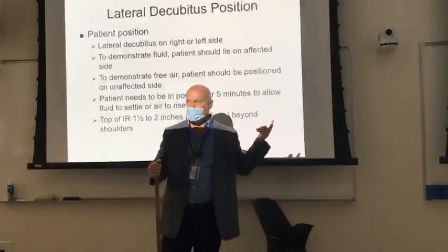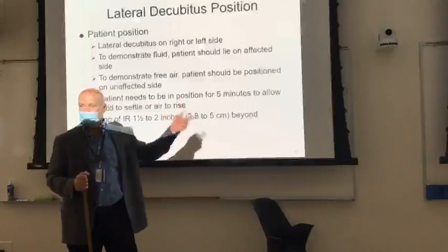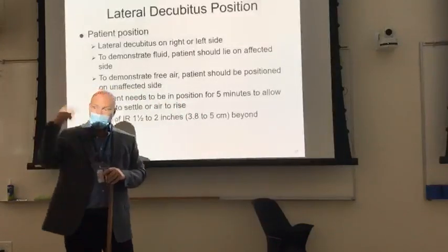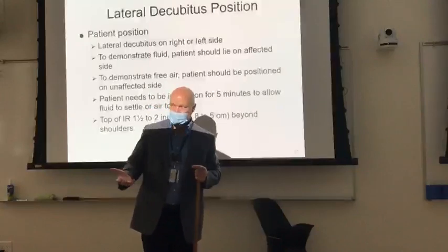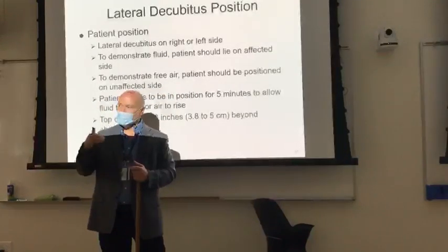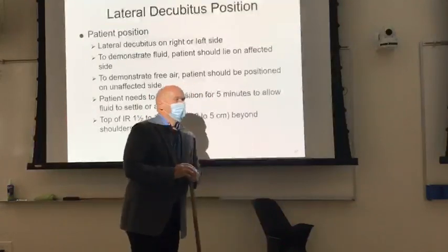I mean, radiologists might grumble about it, but what anatomy are you looking for specific for this case that we're talking about? Top lung or bottom lung? Bottom lung. So are you going to miss the anatomy of interest if you miss that much of the top lung? No. You make sure you get that bottom lung, right? If you got to build the patient up.